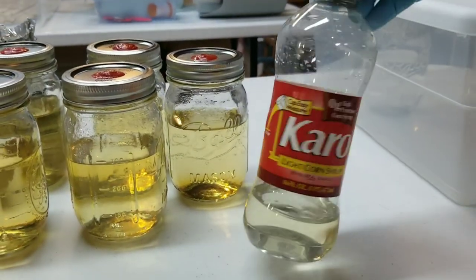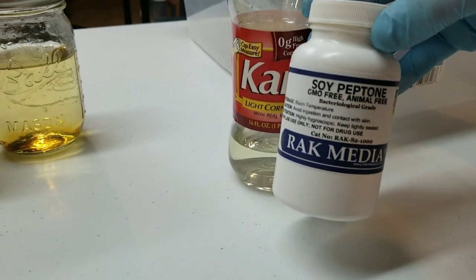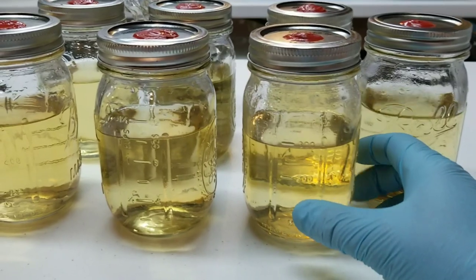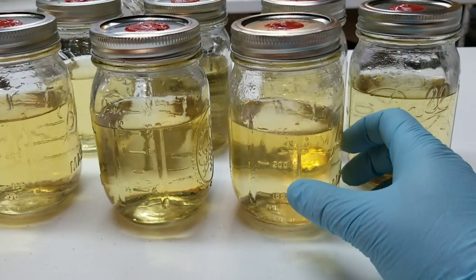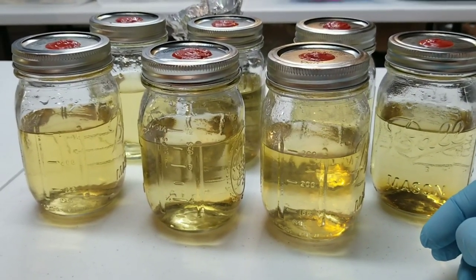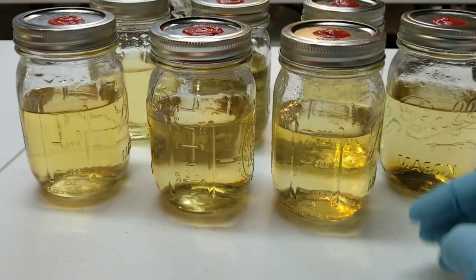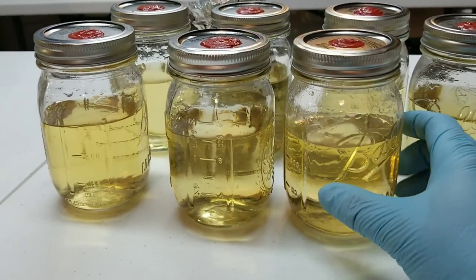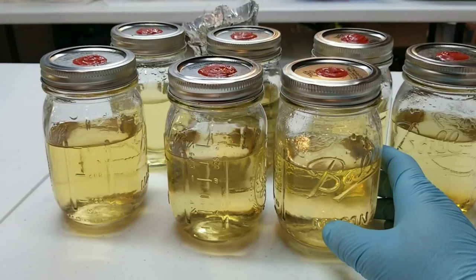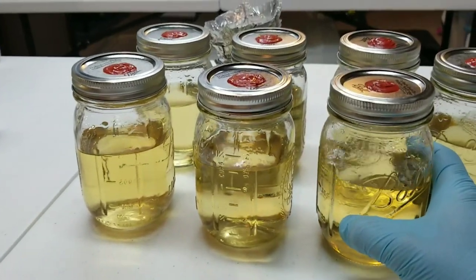I'm using the same liquid culture recipe from the first video — light Karo syrup as the sugar source and some powdered soy peptone. You're going for a four percent sugar solution. I have about 300 mils of distilled water in each jar and about half a gram of peptone per jar. You can use a lot of different sugar sources — honey, dextrose, malt extract — but you have to make sure your math is right to end up with a four percent sugar solution. That's the key.